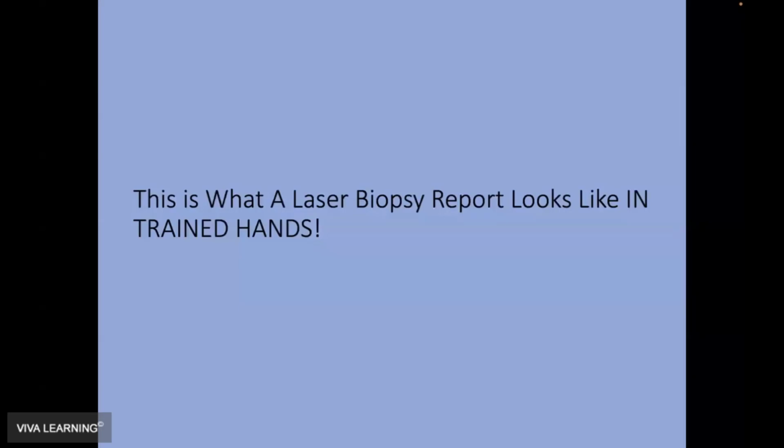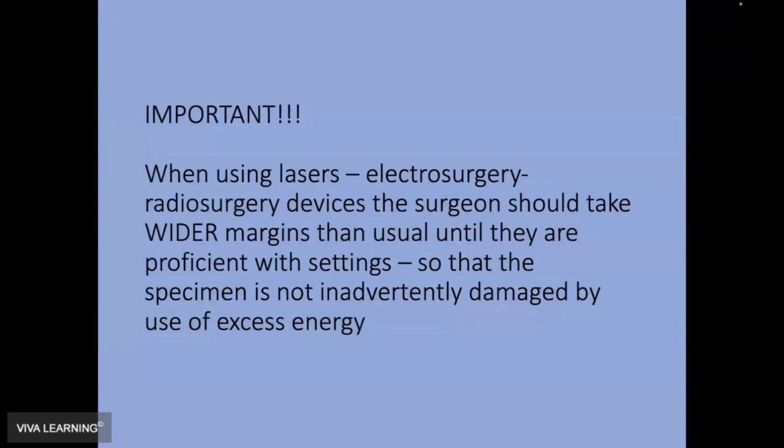This is what a laser biopsy report looks like in trained hands. Once again, I'm not going to read the whole thing. Multiple sections so well delineated, blah, blah, blah. And it says nothing whatsoever about any artifactual changes. Why? Because this was done by a dentist that knew how to use the technology well. And as a result, there was nothing that affected the biopsy at all.